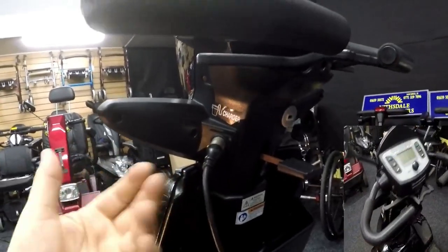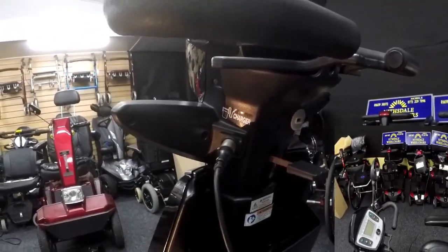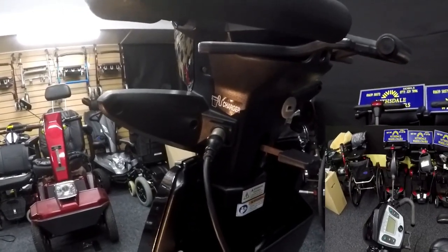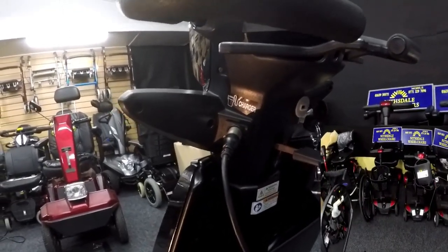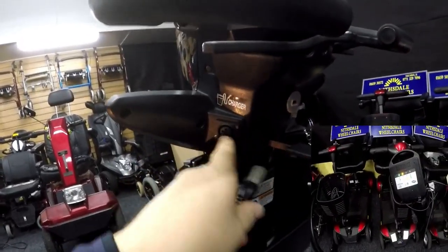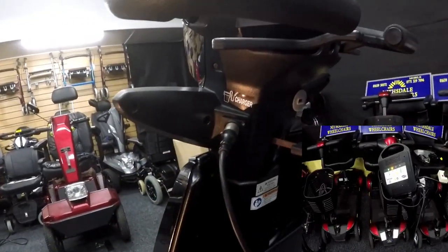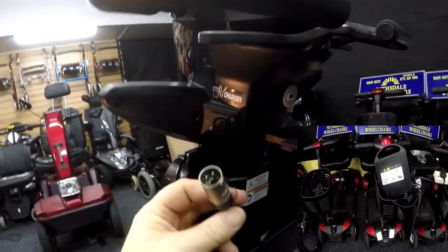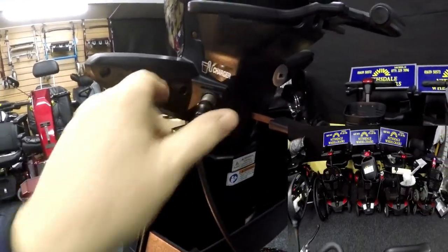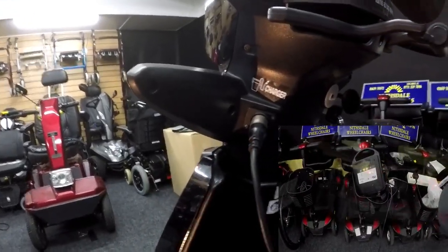I told the customers I would be testing the batteries for them when I've got the scooter, and of course I put it on overnight, and what was happening in the morning? The two yellow lights were on and it wasn't charging whatsoever. So before I even test the batteries, I need to take this off and replace this connection, which I'll show you how to do. I'll replace it with an Invacare one suitable for this 3-pin Neutrik connector here. So I'll leave that on there just to see if the two yellow lights will come on.